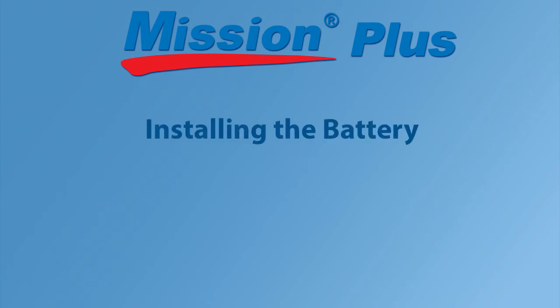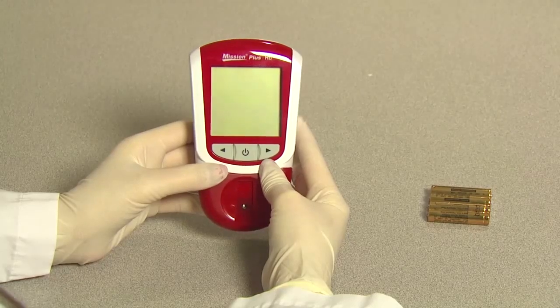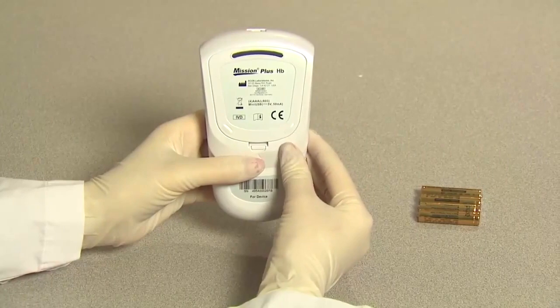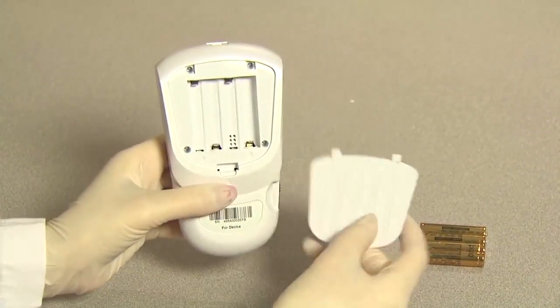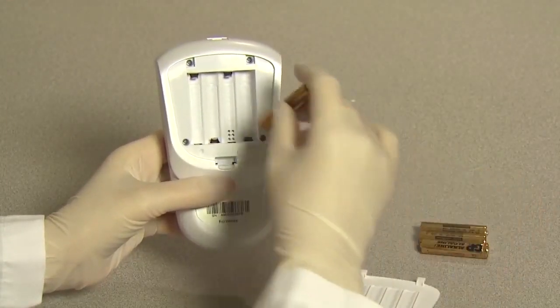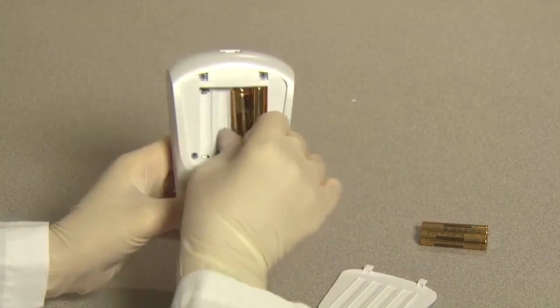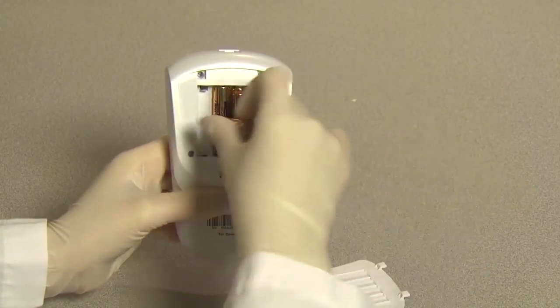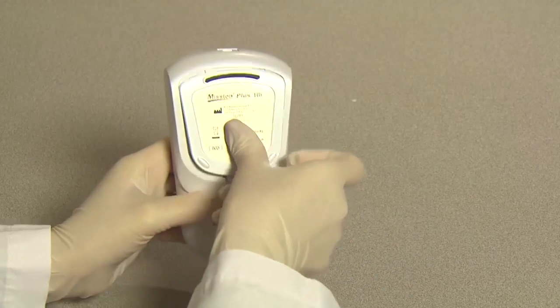Installing the battery. To install the battery, turn over the meter to locate the battery compartment cover. Press the battery cover tab and lift the cover to open it. Insert 4 AAA batteries into the battery compartment. Close the battery cover and make sure it snaps shut.